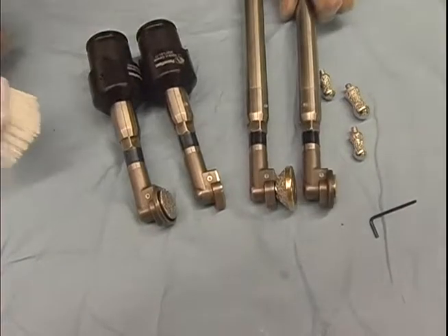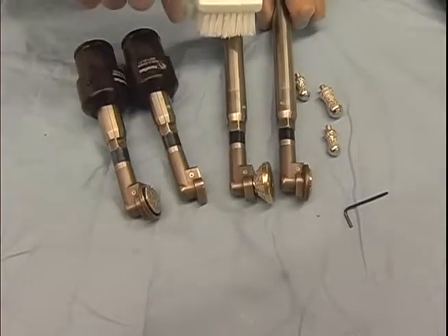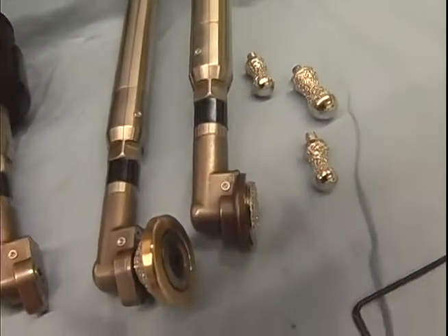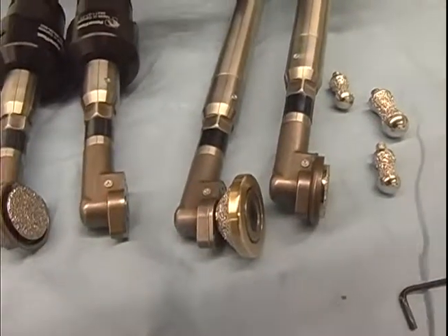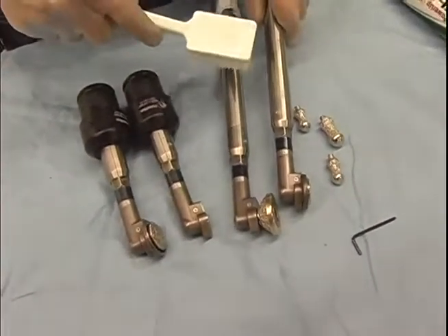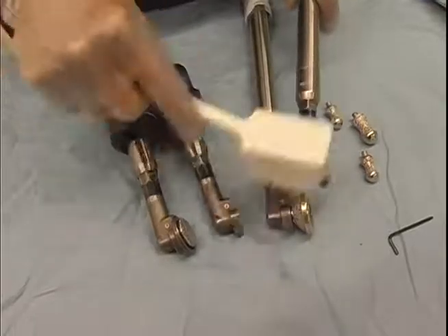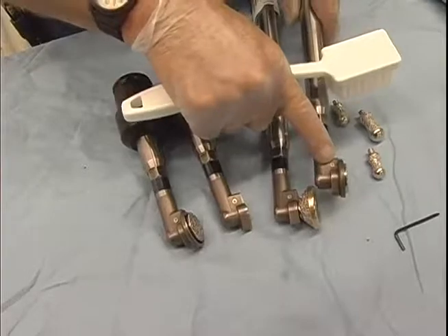While dentistry is being done, the grease ports tend to fill up with tooth chalk. If you look in here, there's a silver ball inside the grease port. Underneath the silver ball is a little spring, which is the spring-loaded check valve. It will get clogged up with tooth chalk if you don't clean these properly before you grease. So the procedure is to clean the tooth chalk out of the well before you grease. Never grease these until you can see the silver ball.